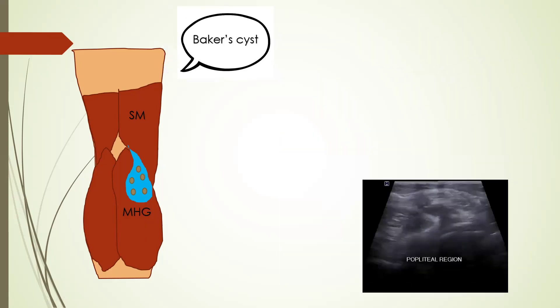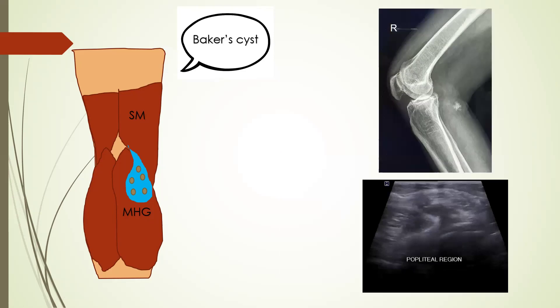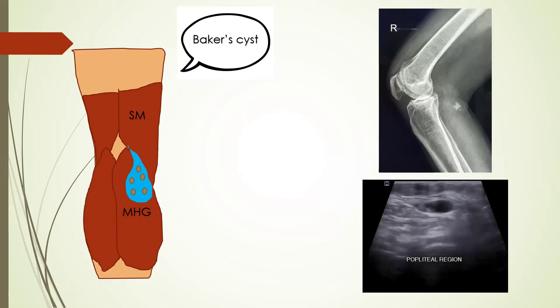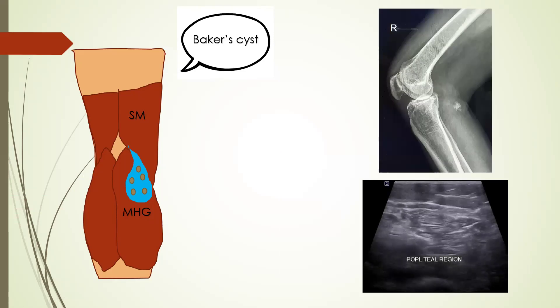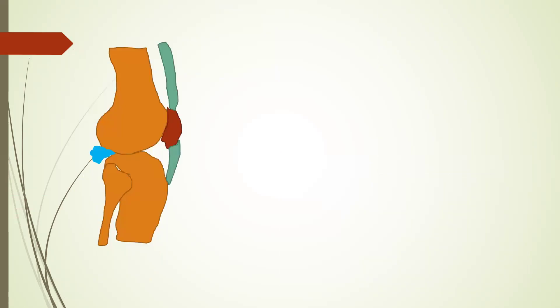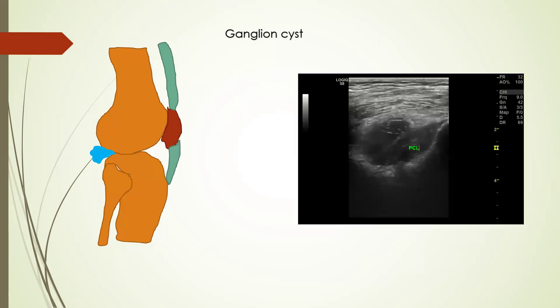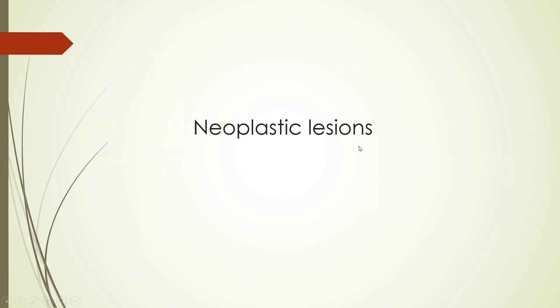Loose bodies within the Baker's cyst may be an indicator of synovial osteochondromatosis. We may also encounter a ganglion cyst in the posterior compartment or popliteal region that may have a relationship with the posterior cruciate ligament, as in this case where the ganglion cyst is seen in relation to the posterior cruciate ligament.